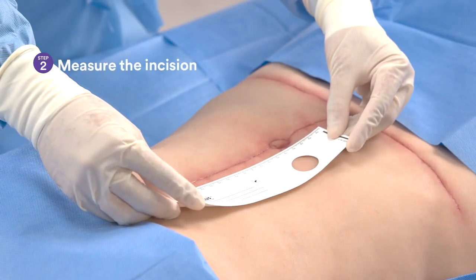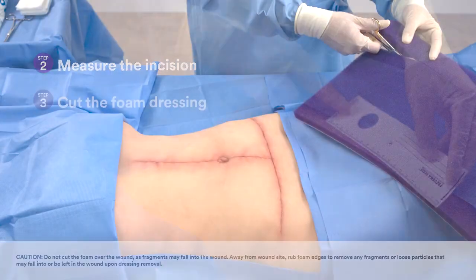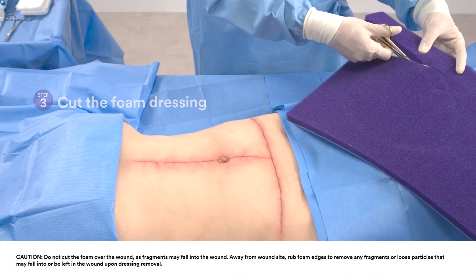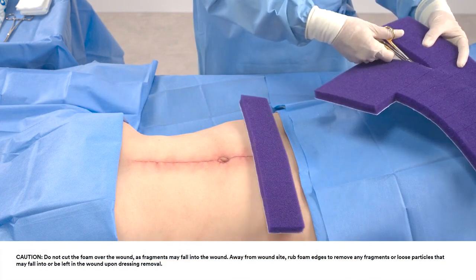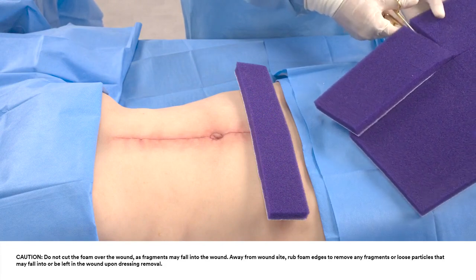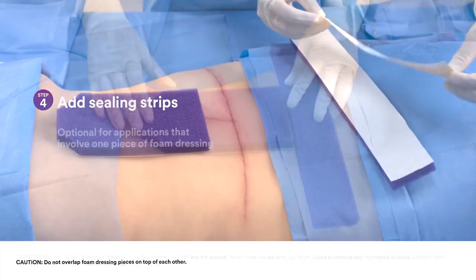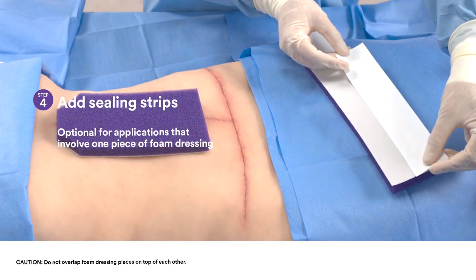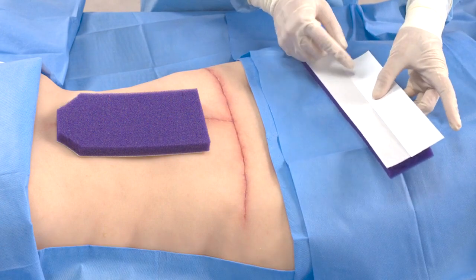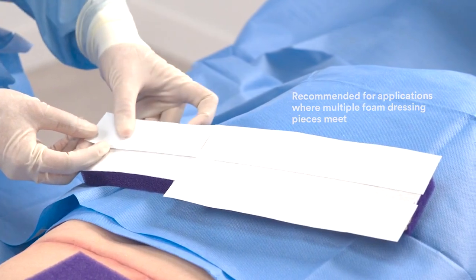Next, use the enclosed ruler to measure the incision before cutting the foam dressing. Cut the foam dressing away from the wound site to the size necessary to cover the incision. The addition of sealing strips is optional for applications that involve one piece of foam dressing and recommended for applications where multiple foam dressing pieces meet.